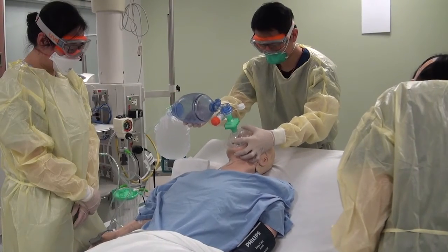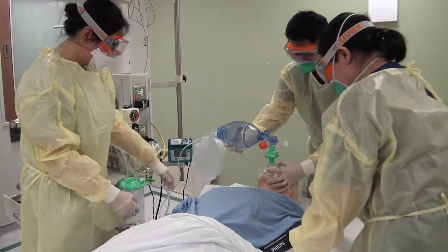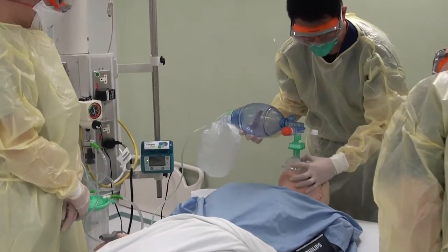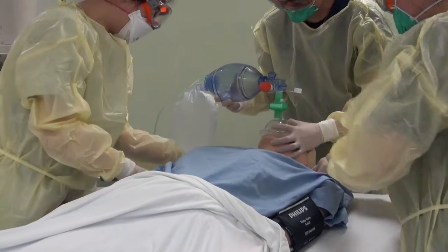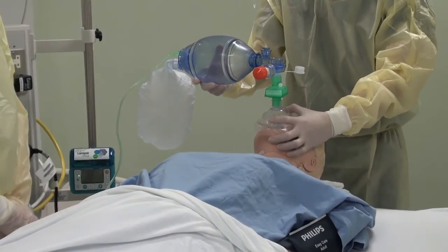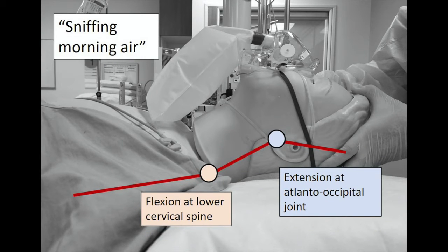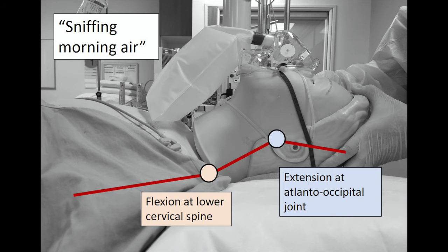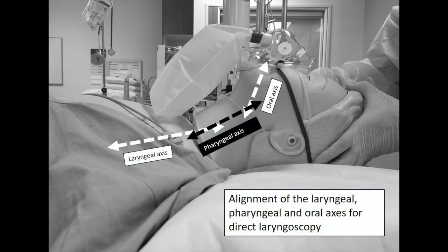Number six is positioning the patient for intubation. This is an important part of the intubation process because a poorly positioned patient will make intubation much more difficult. To do that, we first lower the head of bed, shift the patient up, and elevate the height of the bed to what is most comfortable for the proceduralist. We can also put a pillow or a towel below the patient's head or shoulders. What we are aiming to do is to elevate the tragus of the ear in line with the sternal notch. This facilitates flexion at the lower cervical spine and, with extension at the atlanto-occipital joint, aims to achieve alignment of the laryngeal, pharyngeal and oral axes to facilitate direct visualization of the vocal cords for intubation.